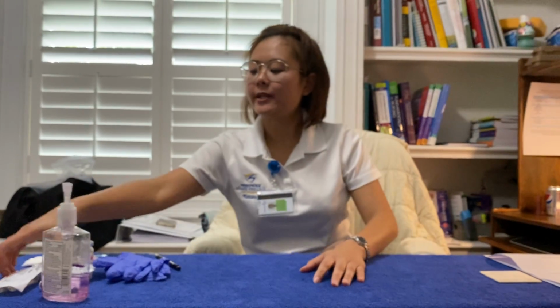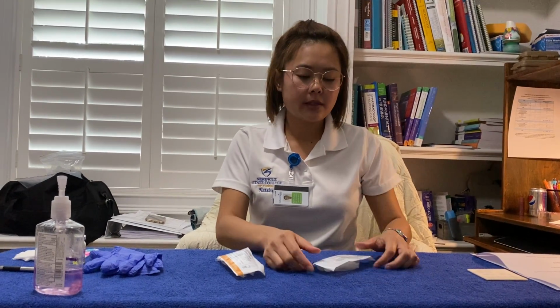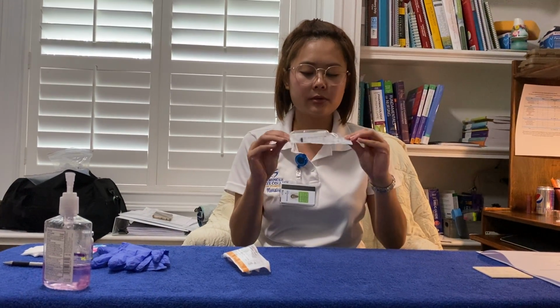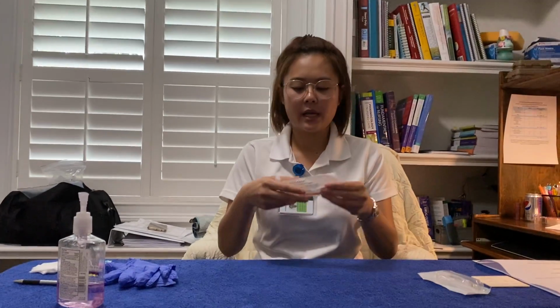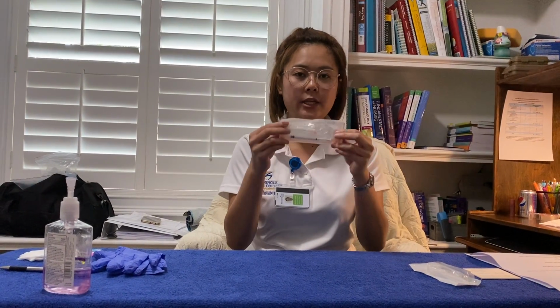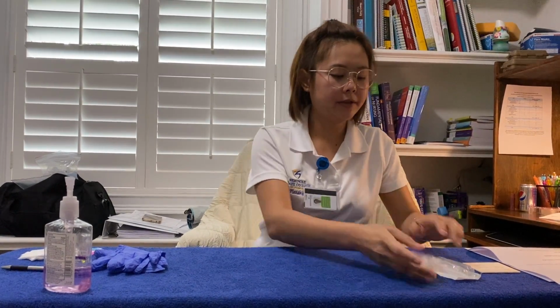Okay, next I'm going to select the syringe and the needle for my injection. For the IM injection, I'm going to use the 3 ml, 22 gauge, 1.5 inch needle. This is for my IM, and the package is not expired. And for my sub-Q injection, I'm going to use the 1 ml, 25 gauge, 5/8 inch needle. And this is not expired.